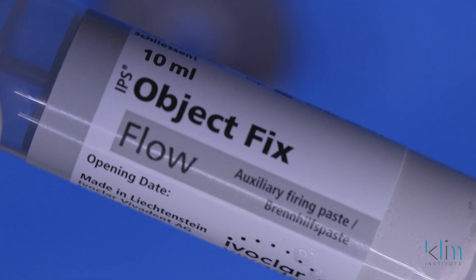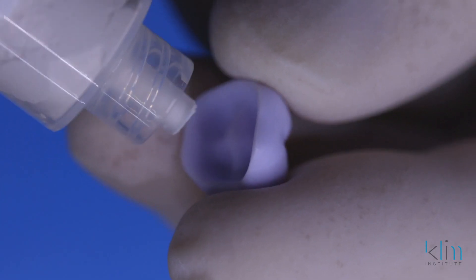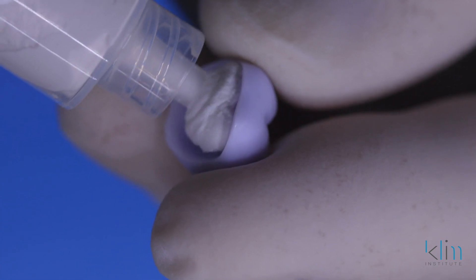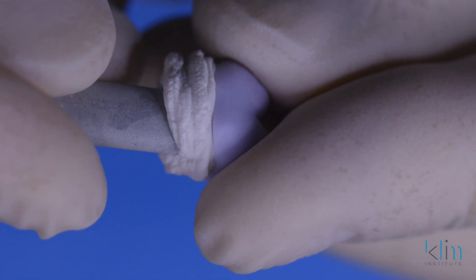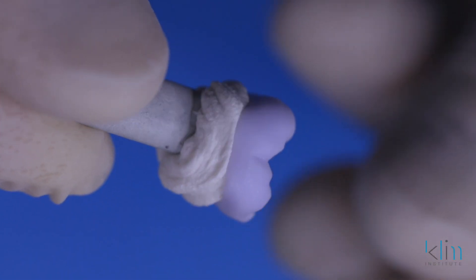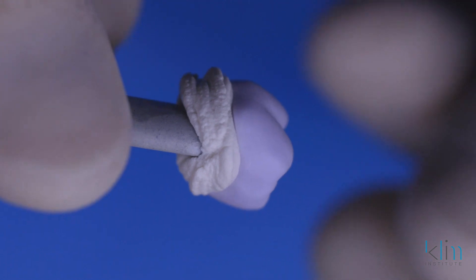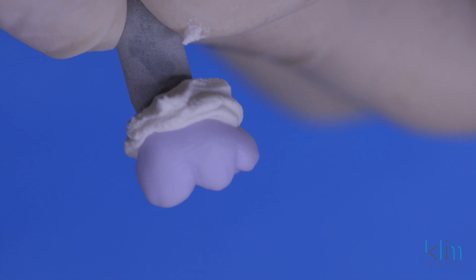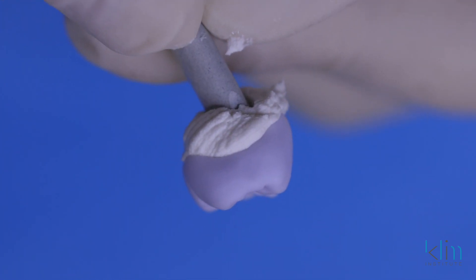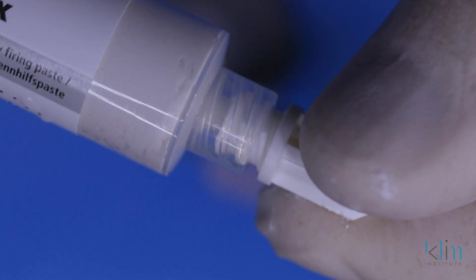Prior to glazing, we're going to load and fill the restoration with object fix — I like the flow. We're going to overfill so when we plunge in that die pin, it spreads out the object fix and seals the margin. Now we're going to check the margins and make sure they're well sealed. Any area that's slightly open, use your finger and just push that object fix up where it should be so the margins are sealed — number one is to support the margins during the firing, number two is to seal them while we're adding the glaze.